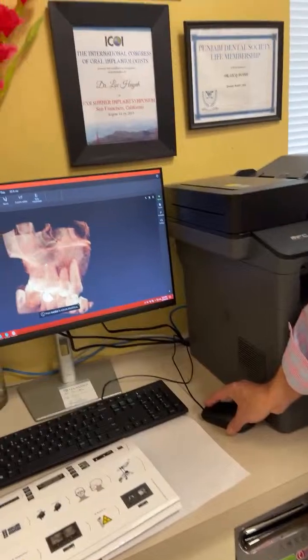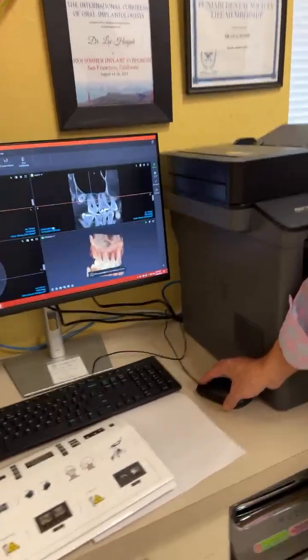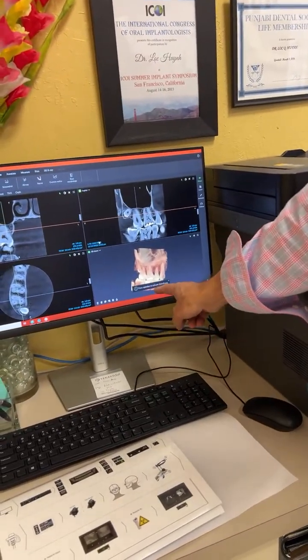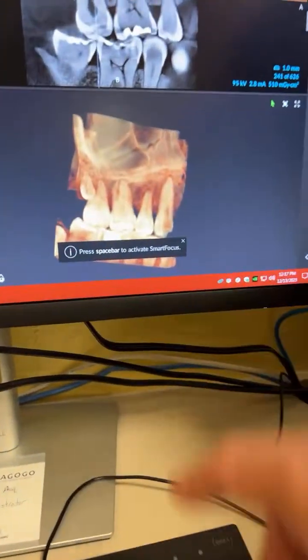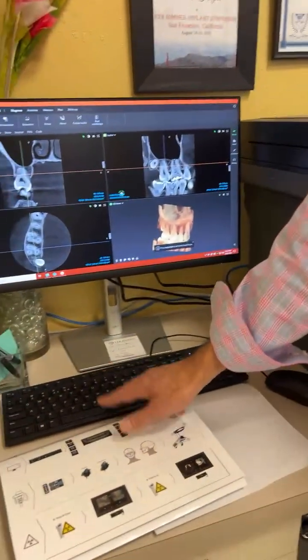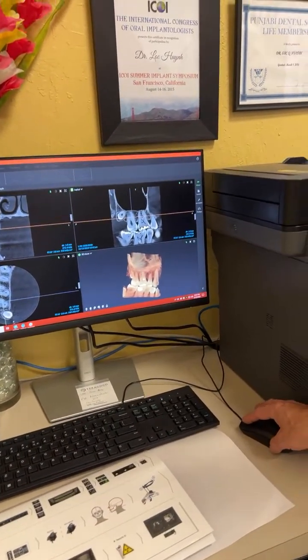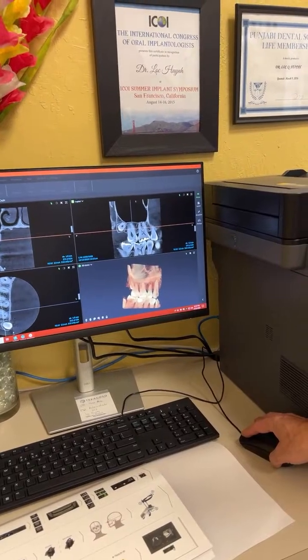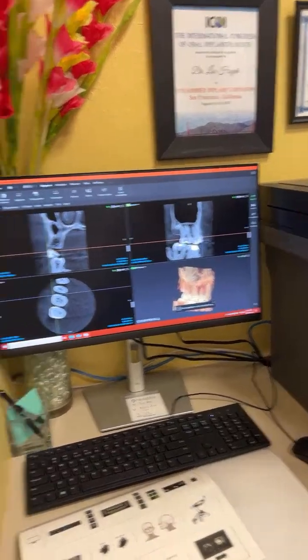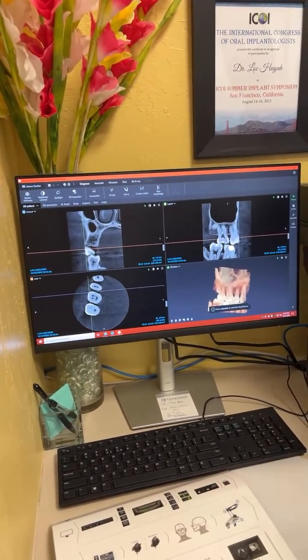You see how I very specifically focus on 3? I didn't want to get any other images in here, but I just want to show you this. See what this is saying? Press the space bar. We use the space bar because it's the biggest key. You just touch it, and now you hover over the teeth to whichever one you want. 3. And this is where it would pull up anything associated with that tooth number. Oh my goodness, if you have periapicals, that's powerful.